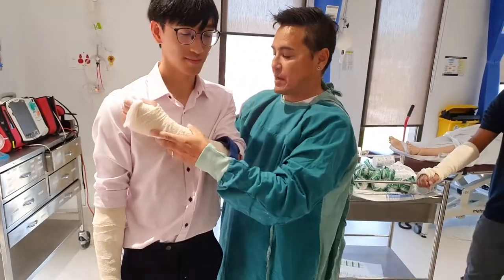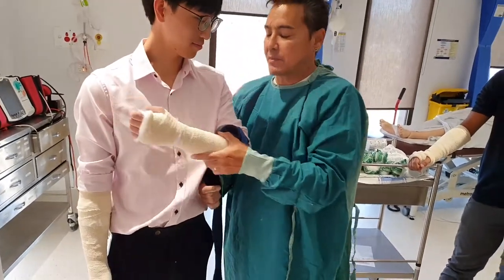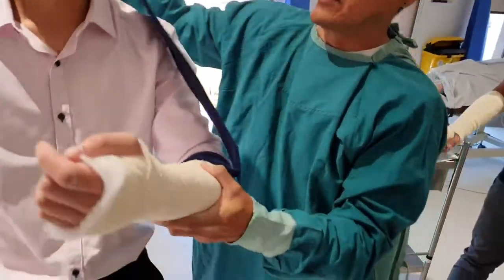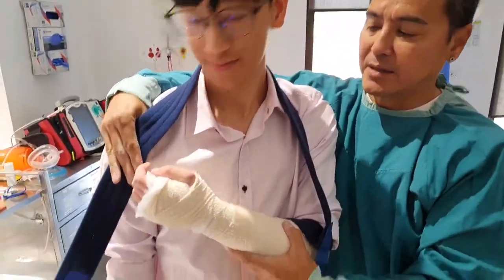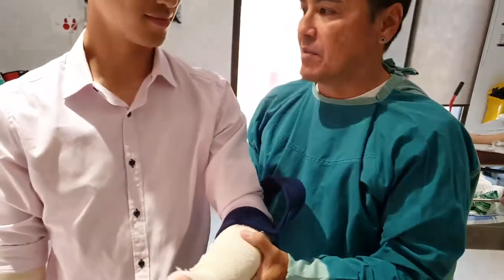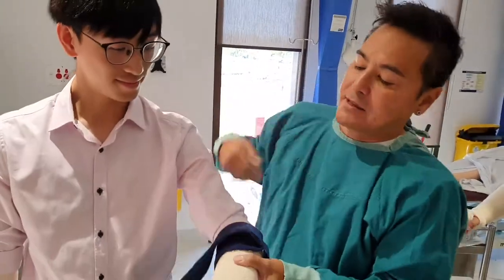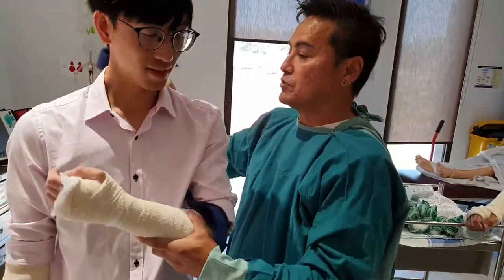You might notice something a little sneaky. A lot of people when they put slings on go over like this — not a fan — because a lot of the weight is on the neck and it's just not comfortable. If you've had to wear a sling before, you'll know how uncomfortable that is.